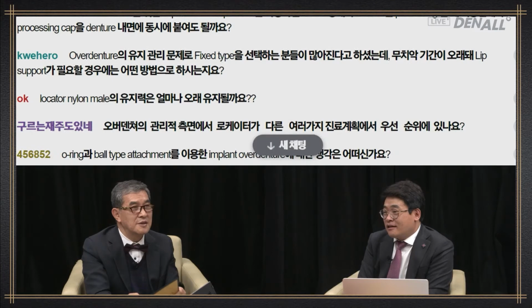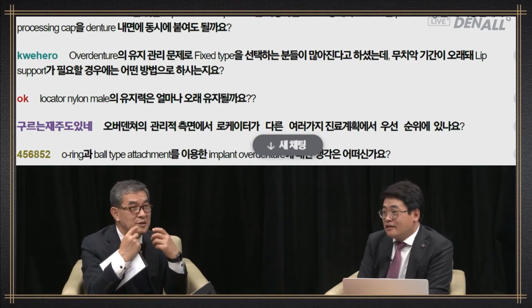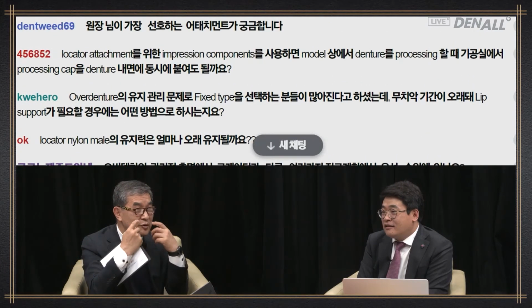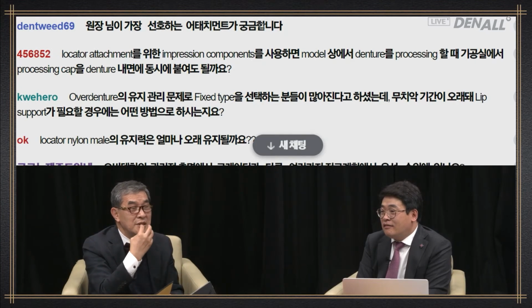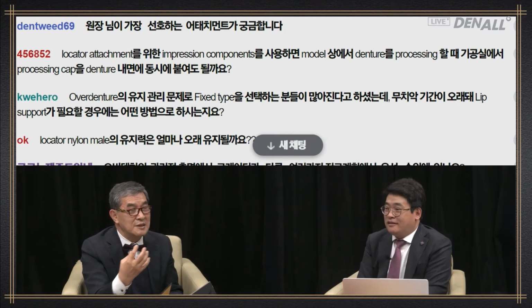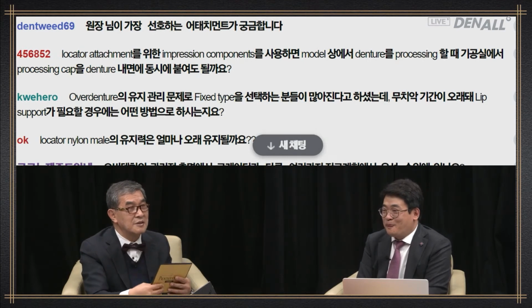If the angulation is minimum, at times you just use the straight, and this can lead to wear on one side because the insertion path is not correct. Therefore, during surgery, you need to place it as parallel as possible. We need to tell the patient to follow the path, and if the patient tries to force it in, it can be a problem. You need to use your hands, and you should not just force it in because it can brush other areas as it goes in.